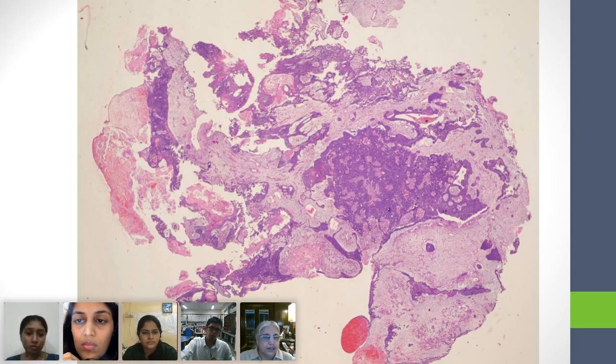And this seems to consist of just two types of elements. One, which was described by Kshitija, is largely a very blue, bluish gray stroma, and it's not very cellular. At this level, you can't see. So it is hypocellular but bluish gray stroma in which you can see the other element. And what is that other element? It's very basaloid. It looks like an epithelial structure that is basaloid and seems to have irregular spaces within it. Can you see that?